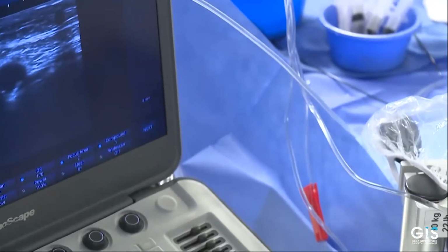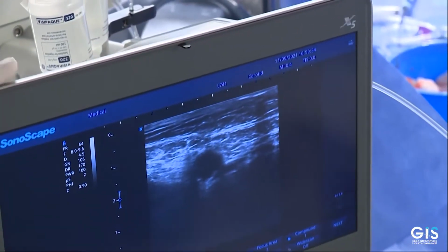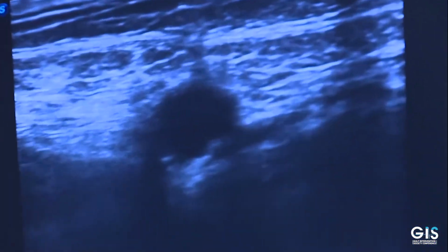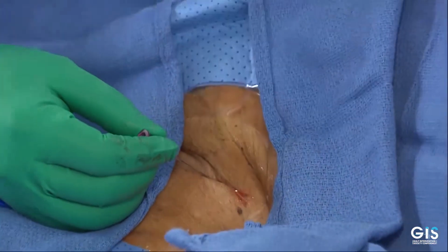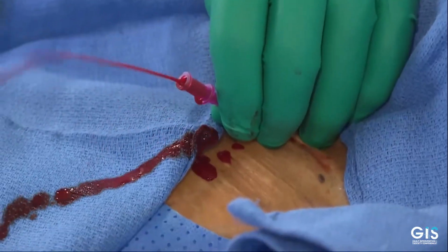You can see it here. You can see my needle coming, and it's just above the artery, and I'm going to gain puncture right now. So stop there. We're right above the artery, so we're going to gain entry point now, and we just made an entry to the artery. So the same goes for our entry for TAVI.